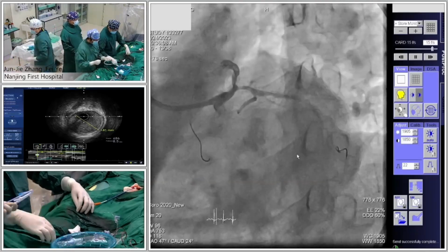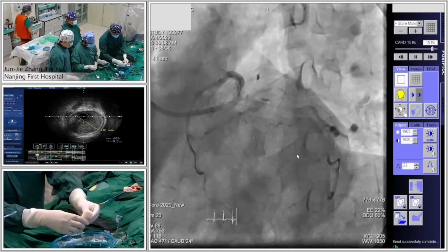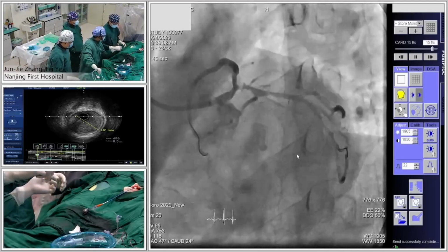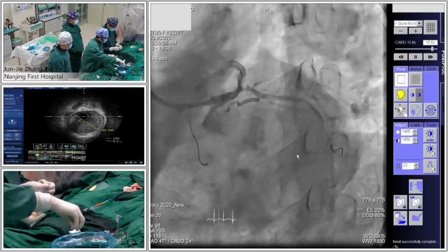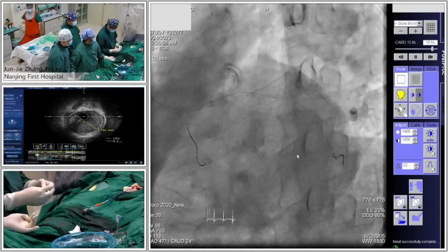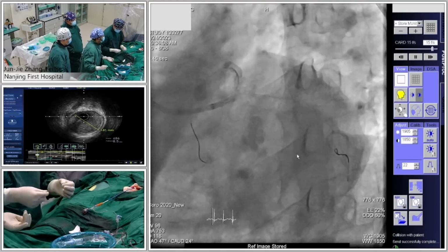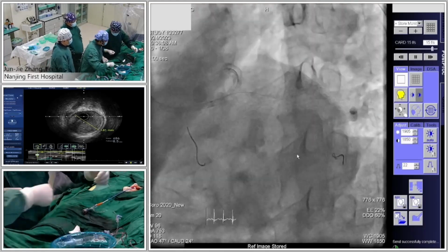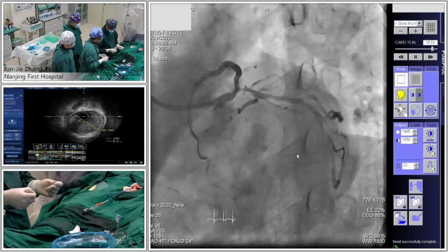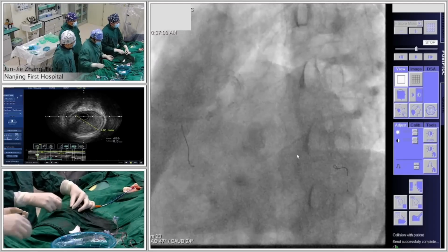And just because the patient was okay, we want to negotiate the side branch first before we treat the distal left main bifurcation lesion. If it needs more time, we can treat the distal left main first. Then maybe I think after GTN injection, the flow will recover better. Then we hope we can try to rewire the side branch. We hope so. Give me Tornus.